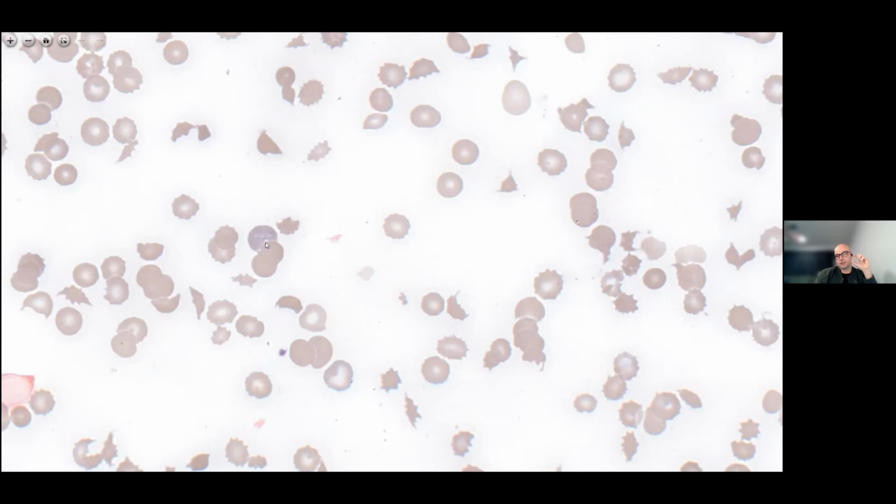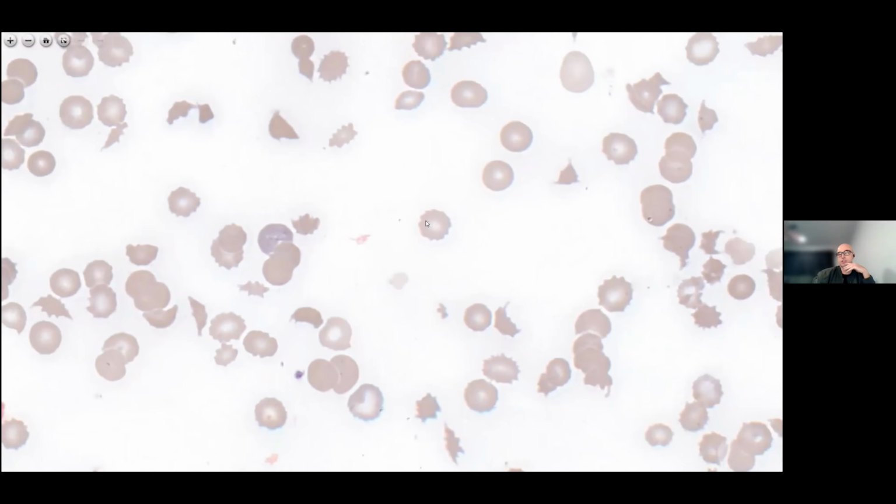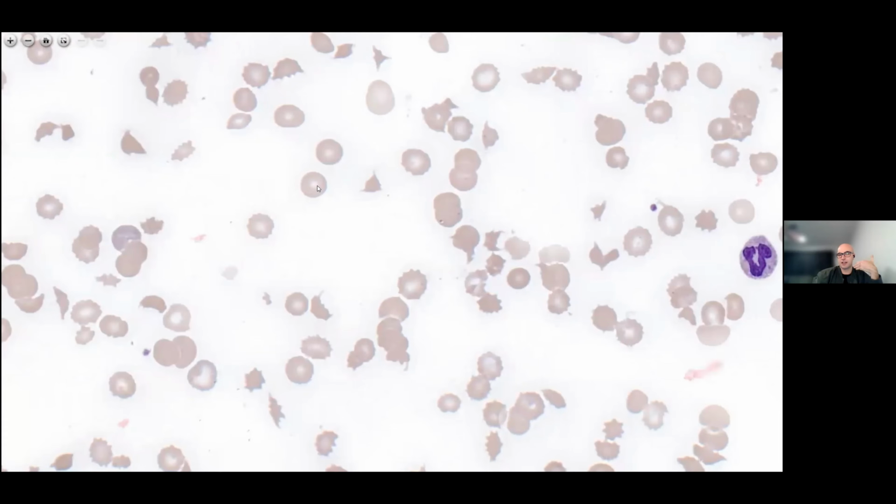And then the nucleus undergoes an apoptotic process and gets extruded from the cell. And you still have red cells that have lots of ribosomes and RNA in them. On a peripheral blood film, they're immature, but they would stain with this polychromatic appearance. So they would have eosinophilic pink and red, and basophilic blue and purple staining characteristics, unlike mature red cells, which just have this eosinophilic staining characteristic.